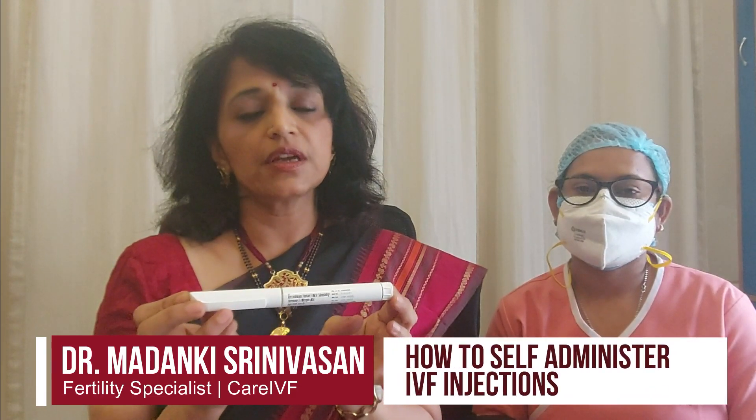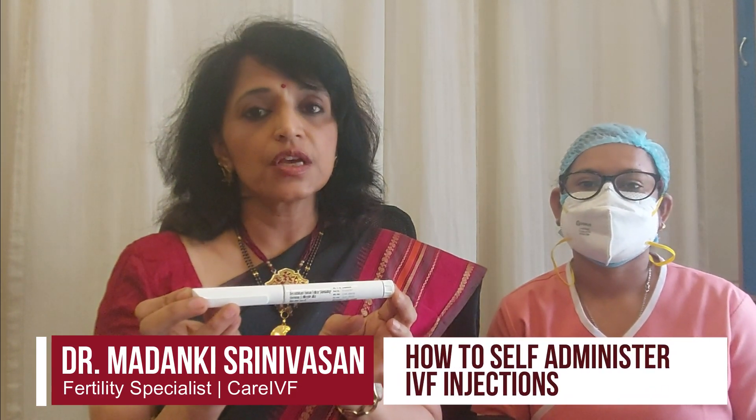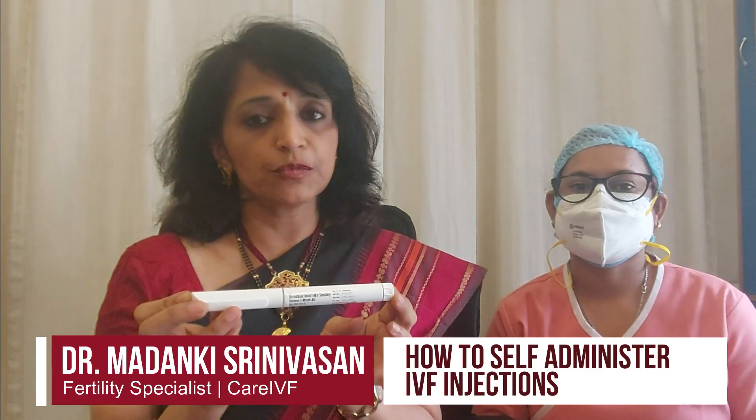Hi, I am Dr. Madanki and I am going to be taking you through a video tutorial on how to self-administer your IVF injections during the process of stimulation.